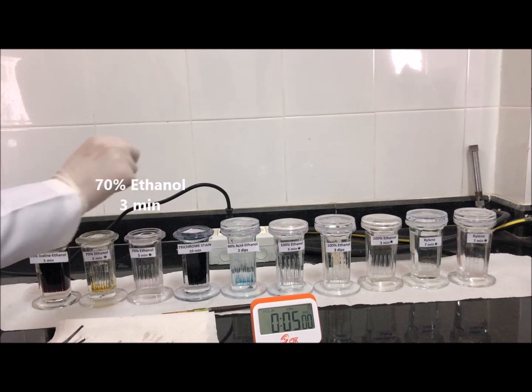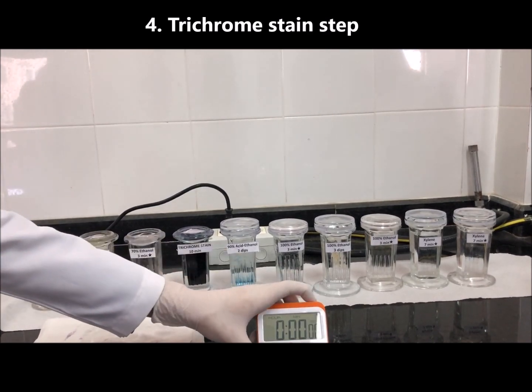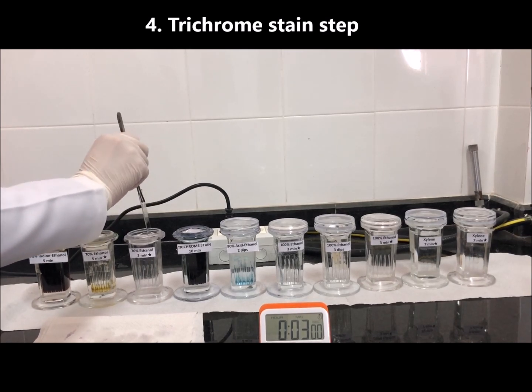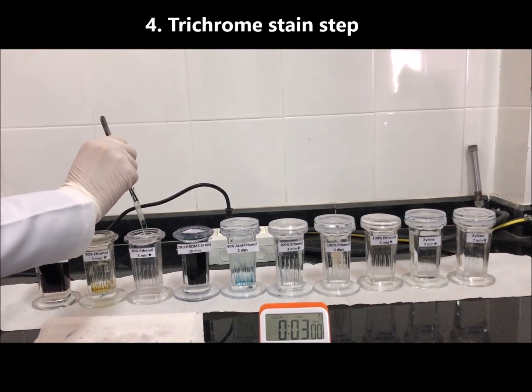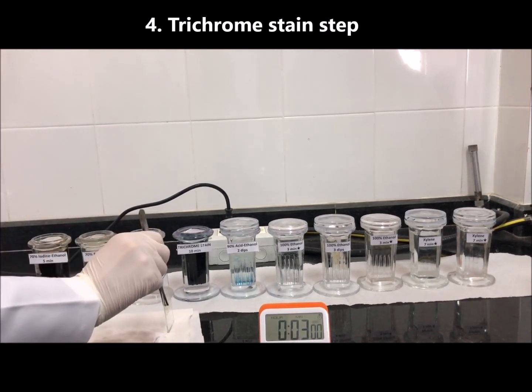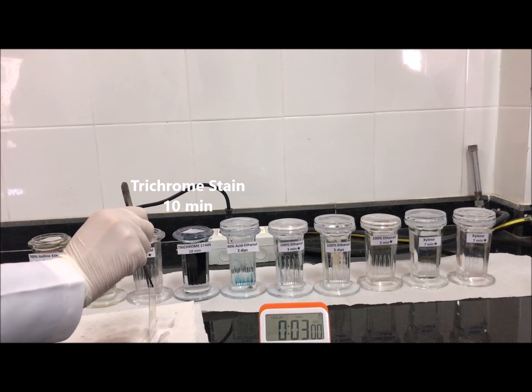Now we come to the trichrome staining step. Before placing the slides in the trichrome stain, drain them again by tipping against the sides of the jar and blotting on tissue paper. Then place the slides in the trichrome stain for 10 minutes.